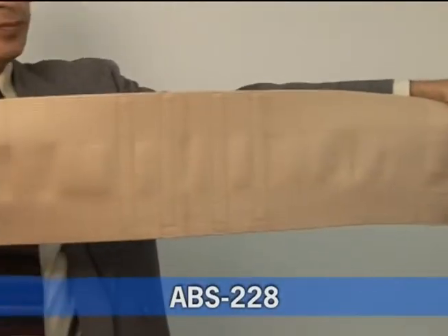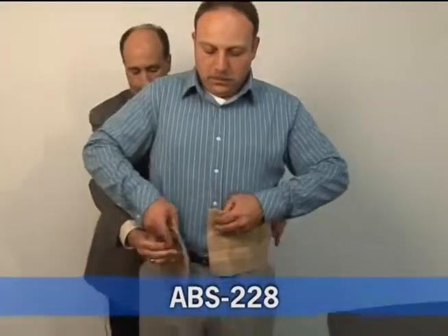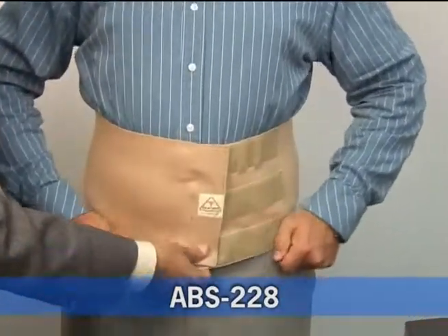This is one of our more unique designs because it allows for both abdominal and back support. Wearing this belt is easy. Because it has just one pull, simply wrap around and adjust accordingly for comfort and support.